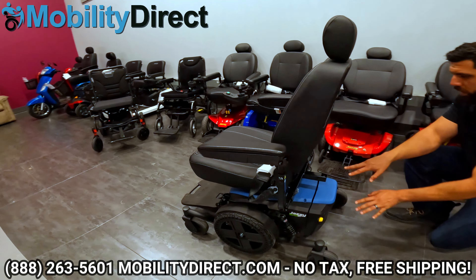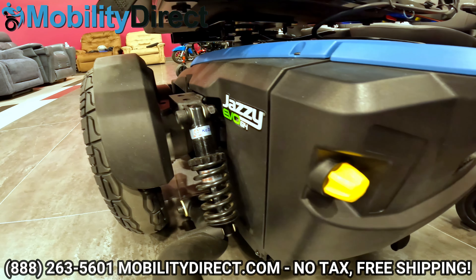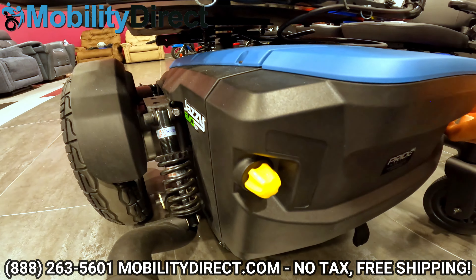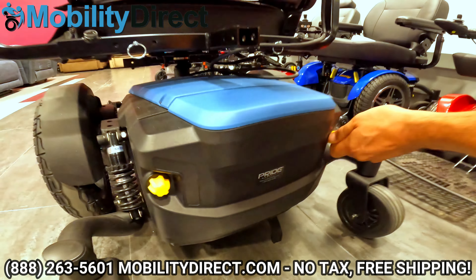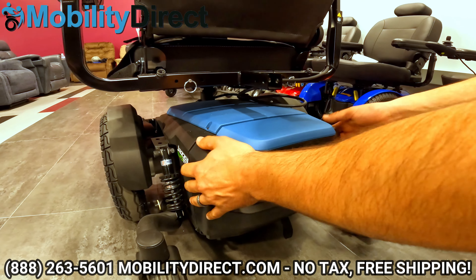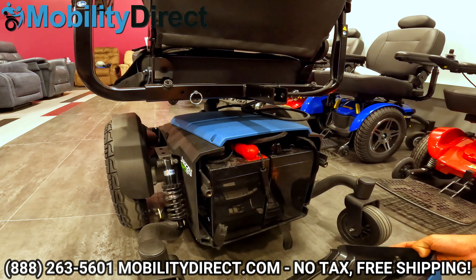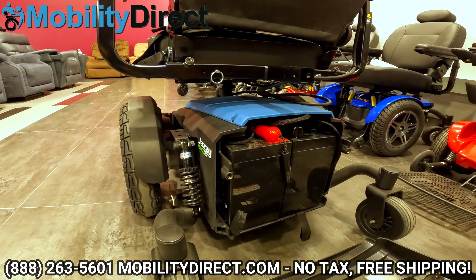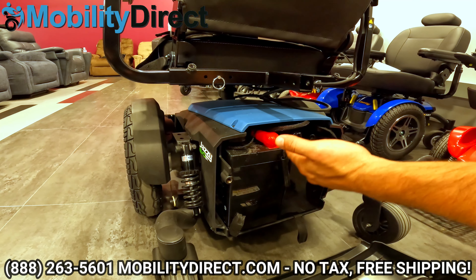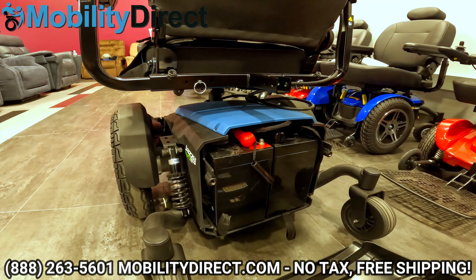Coming towards the rear, you can see the suspension which is adjustable in the rear as well — it has four suspension coils in total. These yellow hand screws are used to access the battery compartment. If you need to change your batteries, you don't need to take the seat off — it's very service friendly. There's also a panel you can take off in the same fashion to access the controller for diagnostics and repairs to the wire harnesses. The two 12-volt lead acid batteries inside are simple to change — just disconnect the nut and bolt for the positive and negative on each battery.